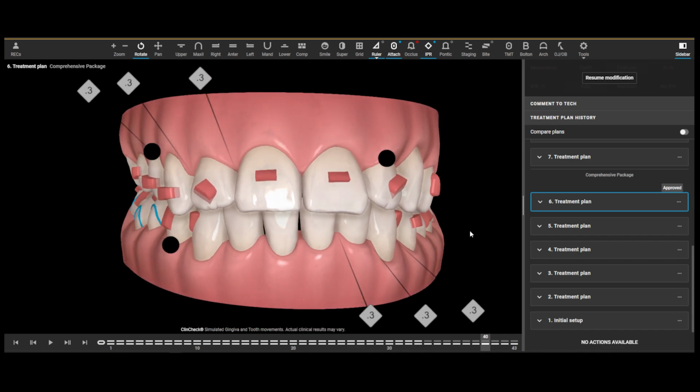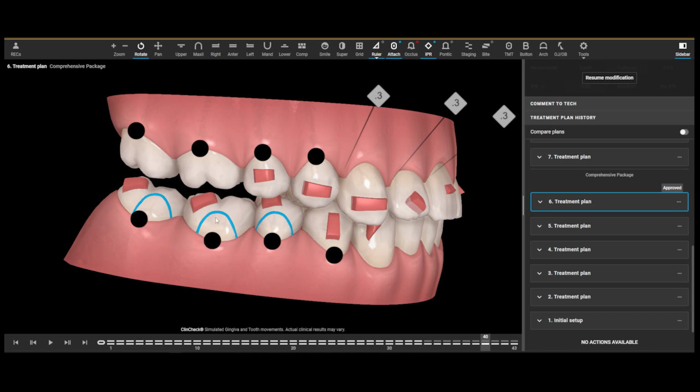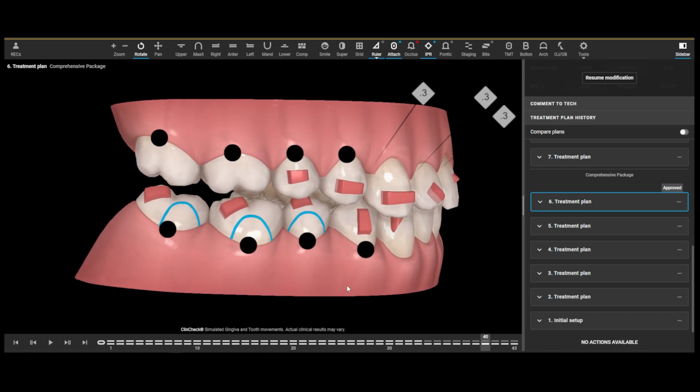Okay, so where are we placing the TAD? So we know we need intrusion in quad 1 and quad 4. For all the Americans that are on the call, I do not know those teeth numbers, so you have to learn the Canadian system. Quad 1, quad 4, those teeth are intruding and extruding. So where do we need to place the TAD?